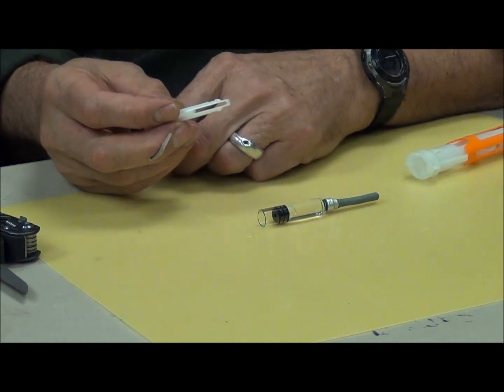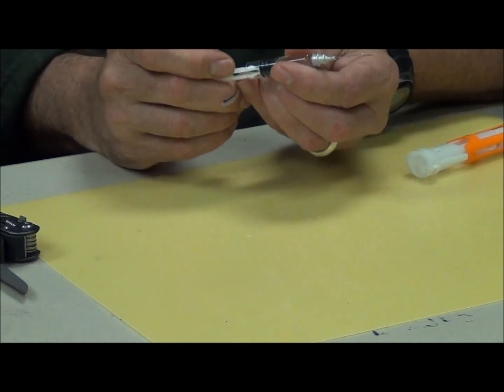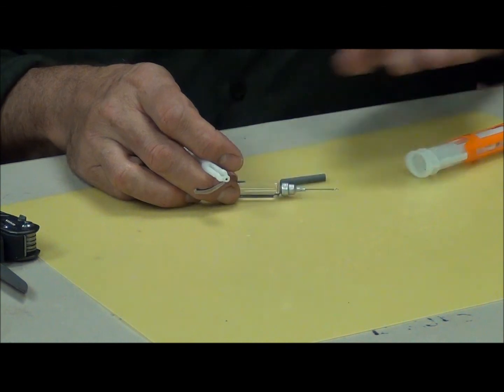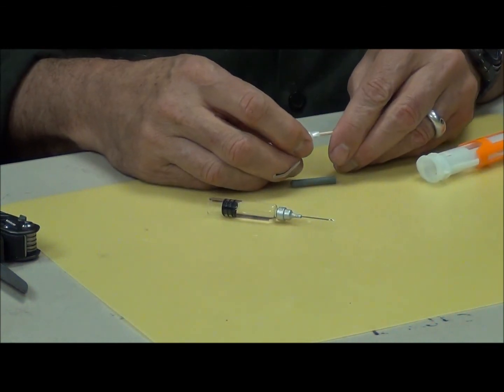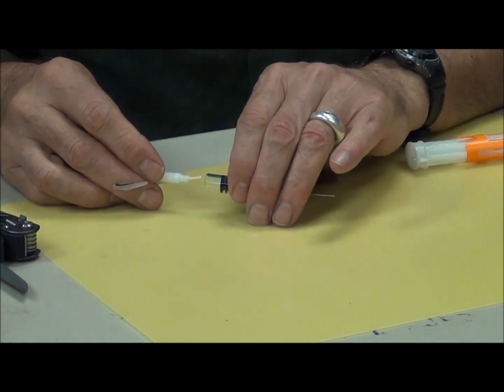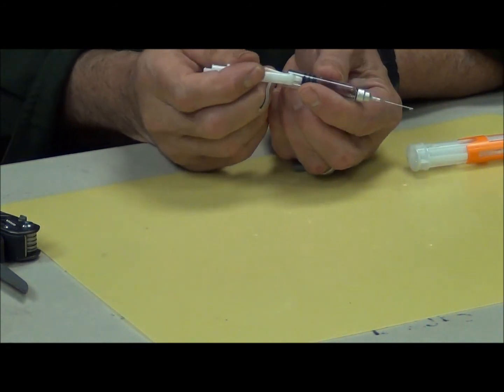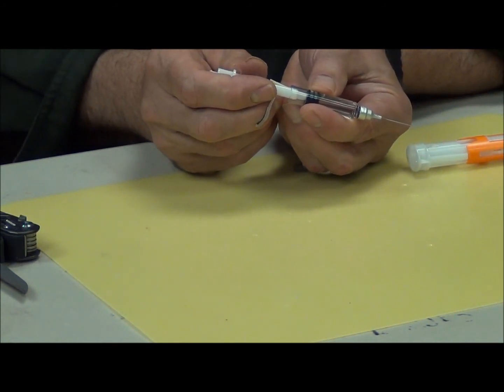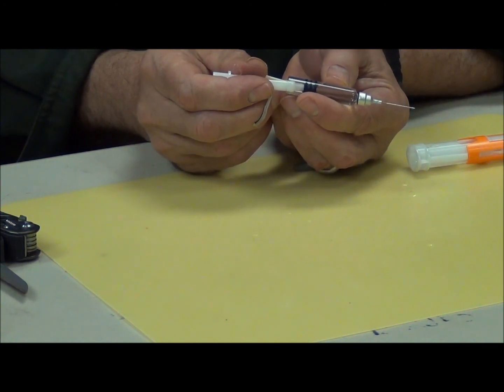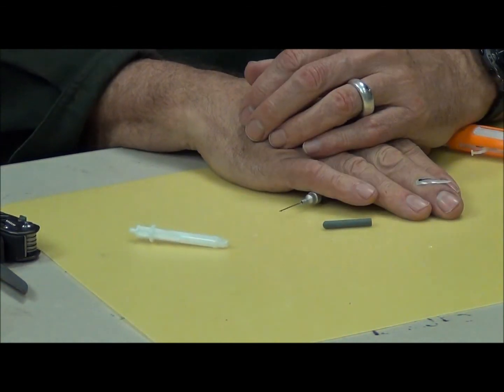This piece can now be used to inject same as the other piece, or if you want to be more precise, you can take a small stick like a toothpick. It will fit very nicely into the slotted end and then can be used to engage the stopper. And again, we want to have the needle into the individual and advance this about 3/4 of the width of the stopper. Again, there's about another 3 or 4 doses of epinephrine in the vial once it's removed from the syringe, as we just demonstrated.